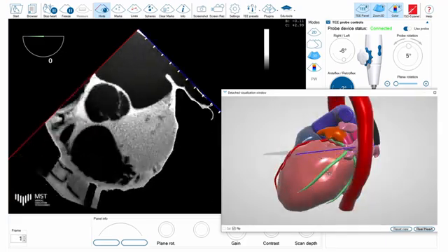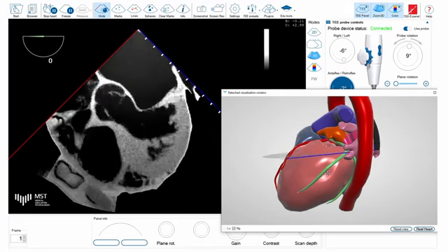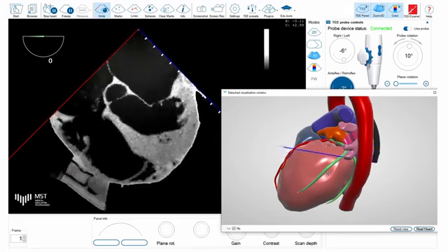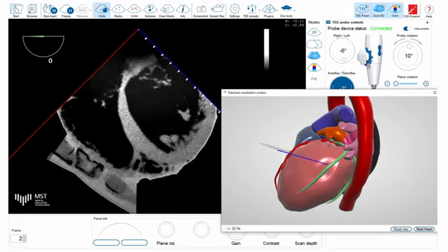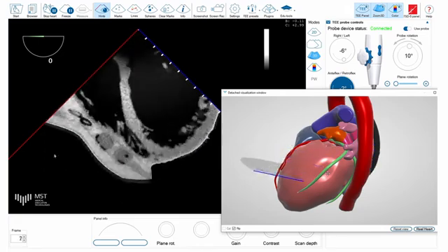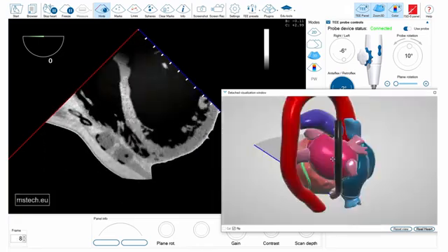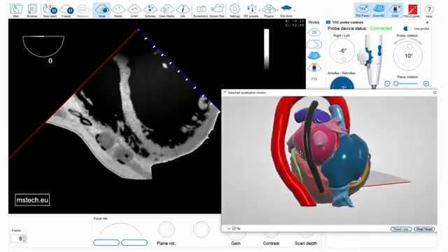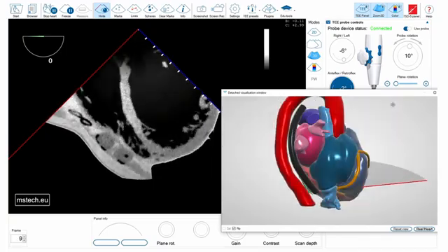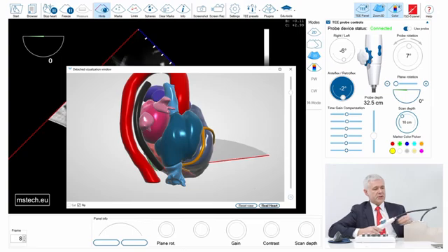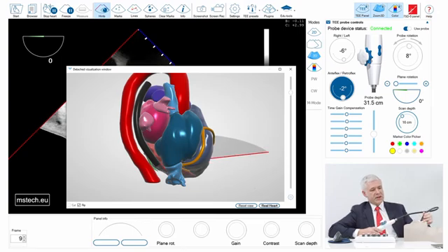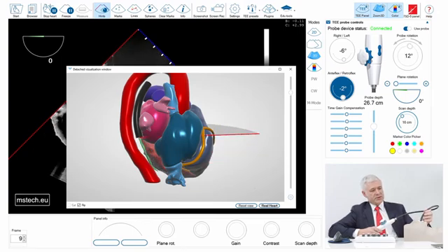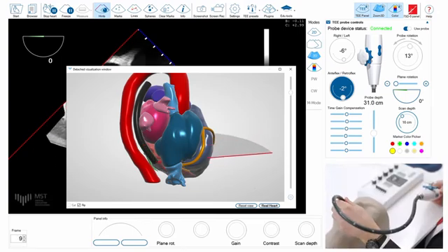Here we can see when I insert the probe into the esophagus it goes down, and I can rotate the model to see where the probe is at a given moment. I can also observe all the manipulations, including probe insertion depth in centimeters.